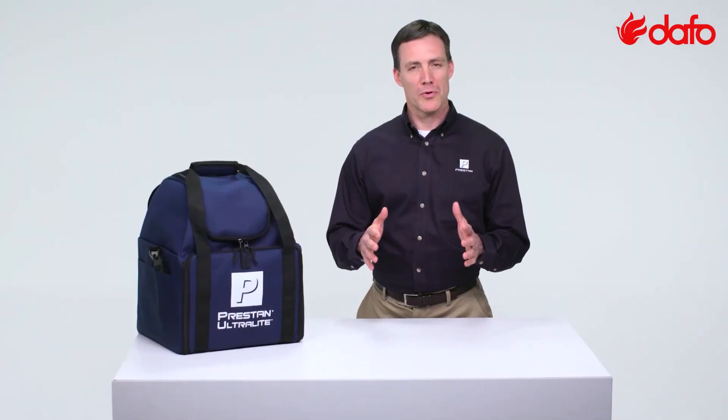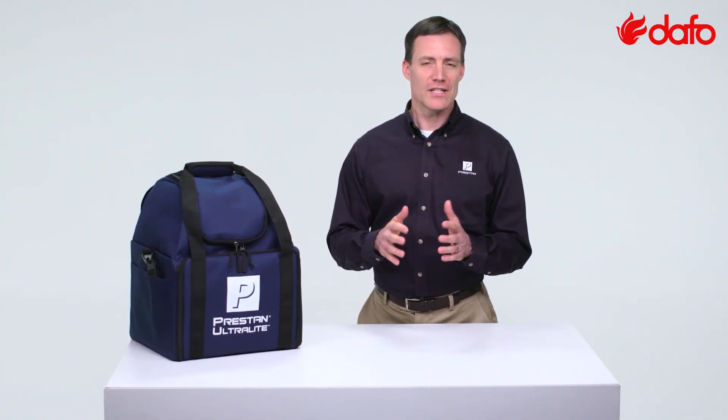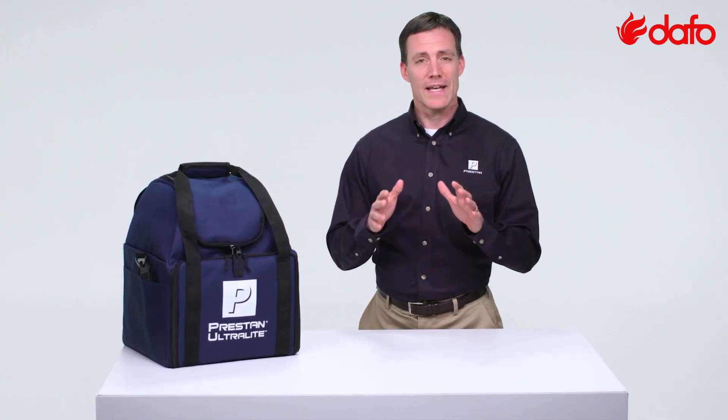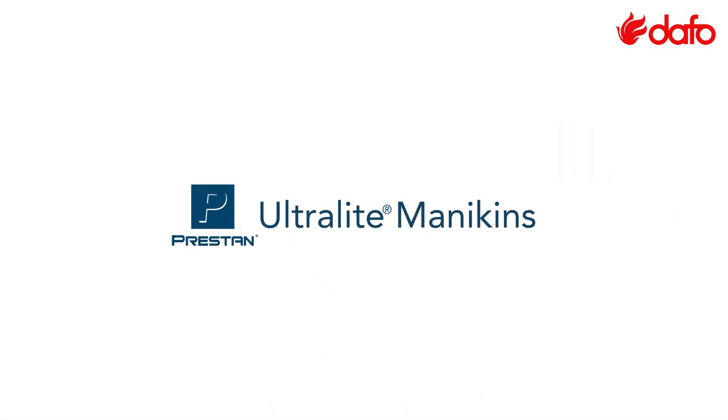The problem with most portable mannequins available today is that they are unrealistic and they just don't last. Preston provides a durable yet lightweight compact set of mannequins with a realistic appearance — the Preston Ultralight Mannequin 4-Pack.